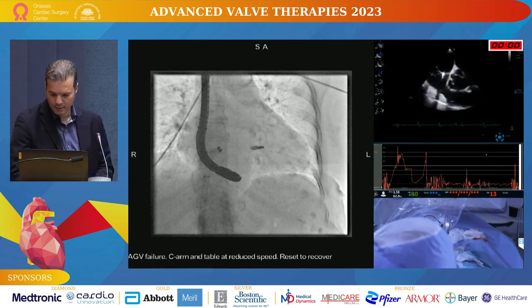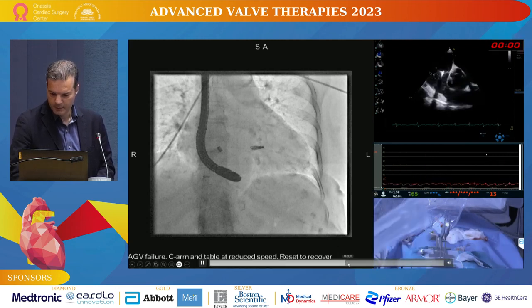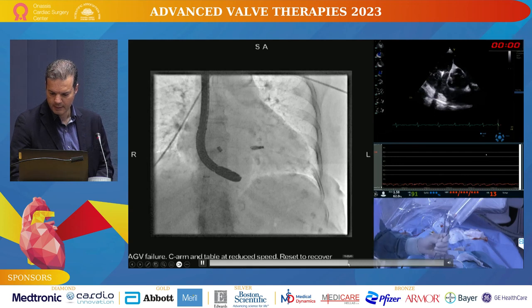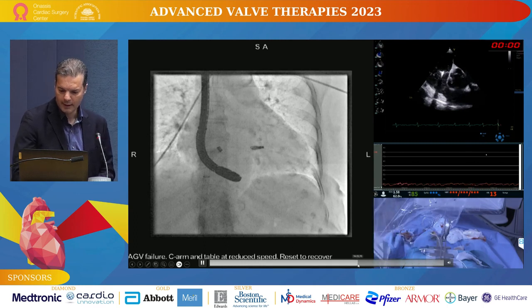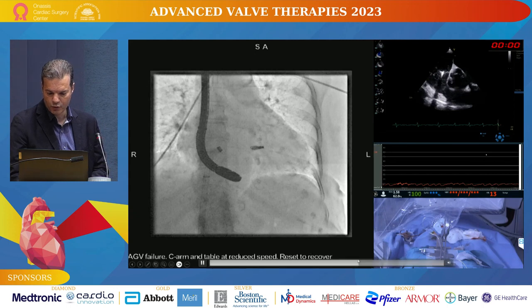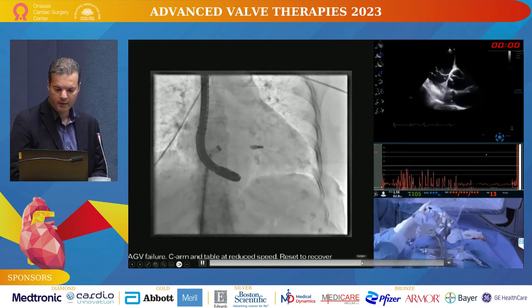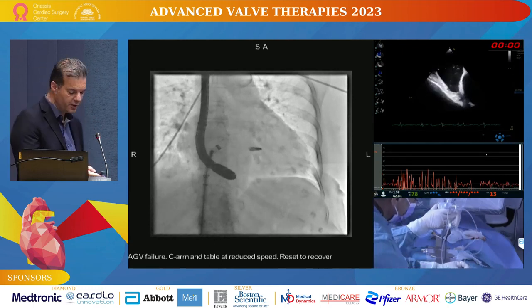And we're just going to prepare the clip. This is the clip. Now, putting a second clip as in the mitral position is actually quite easy to do, easier than the first one usually, because you have your first one as a marker. So the same maneuvers again, clip goes in, but you have your reference point.